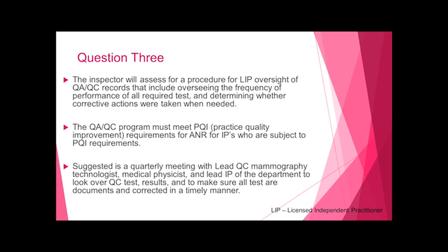Now, the QA/QC program must meet PQI, Practice Quality Improvement, requirements, for the interpreting physicians who are subject to PQI requirements.